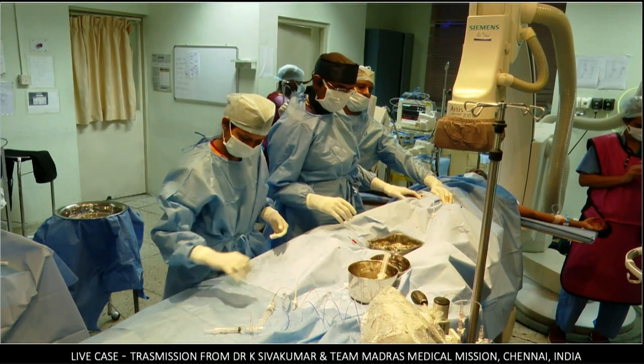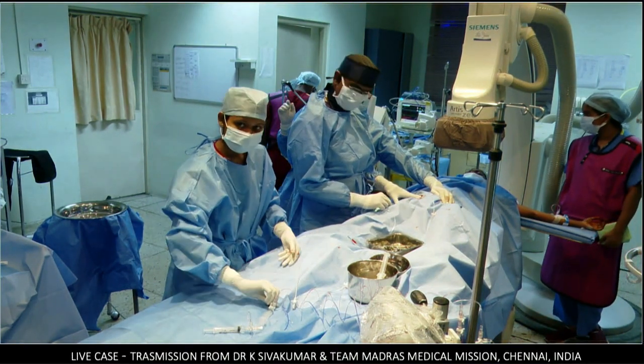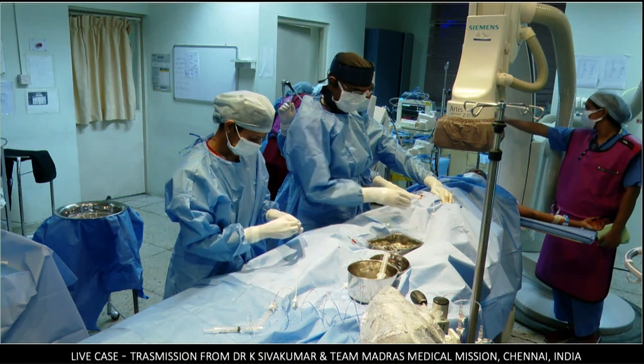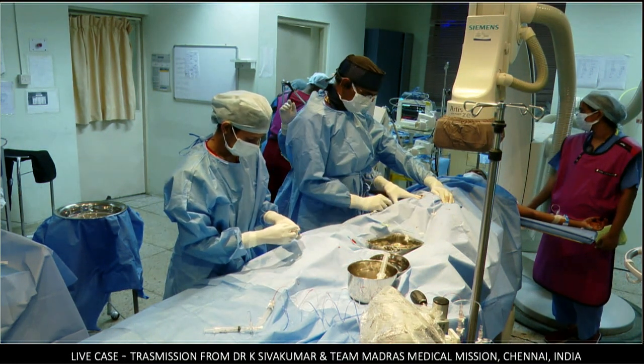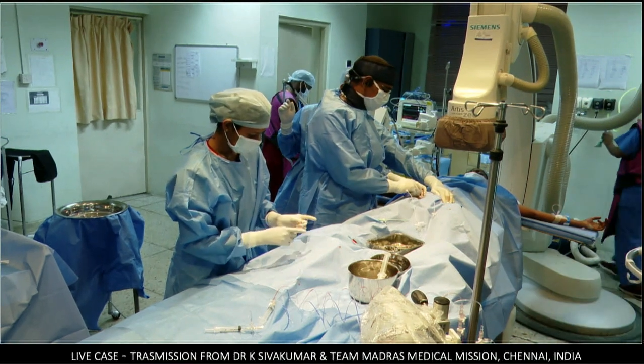So, would you like to comment on this case? Yes, Steve, I just wanted to ask, you don't use 100% oxygen to test, and when you use nitric, is it in room air as well? No, nitric oxide with around 5 to 6 liters of oxygen.